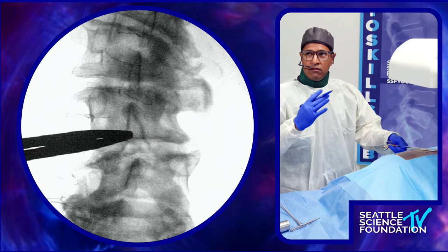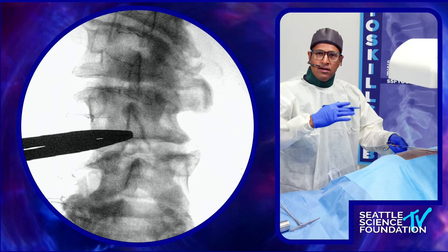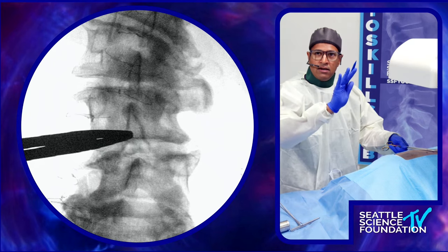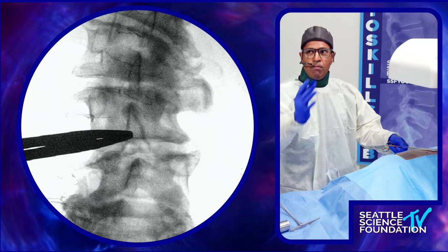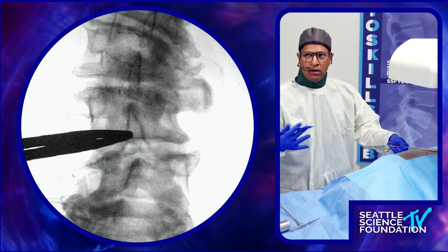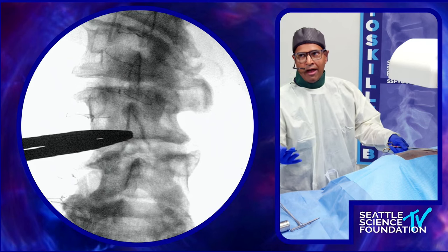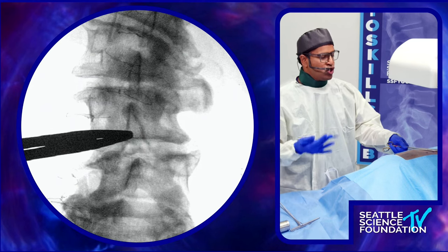If the patient has significant rotatory scoliosis, what I do is rotate the bed so that zero degrees on the C-arm is perfectly AP on that patient. That way, when I go back and forth between lateral and AP, I'm getting true orthogonal views rather than starting with an oblique view that's AP — and then when you go lateral, the C-arm can't over-rotate.